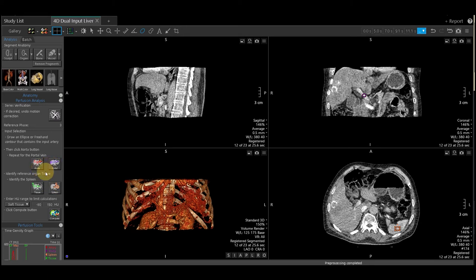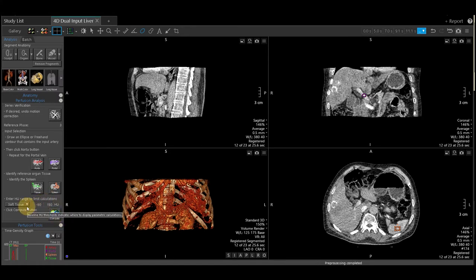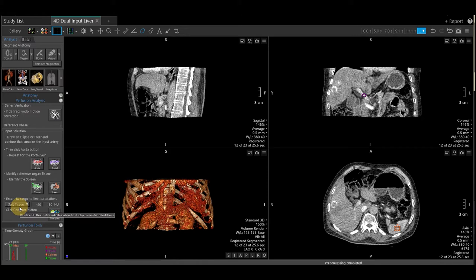Once I have placed all four ROIs, the compute button becomes active. We are doing soft tissue calculations. We do have air as an option, but that is for our lung perfusion. We will select soft tissue and hit the compute button. By selecting compute, it will display our maps for us.